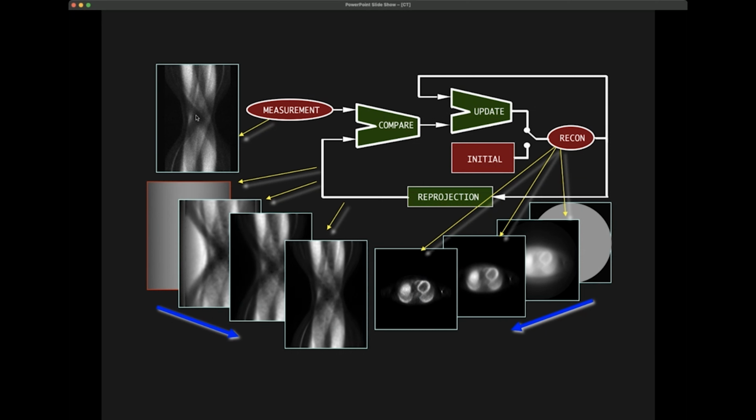Because theoretically, what is measured, that is measured. While here, you can somehow compensate for the fact that there is noise. When you do this comparison, you could say, look, it should be as close as possible, but if we know we have a certain noise distribution, let's see what's happened, and then we can take that into account.